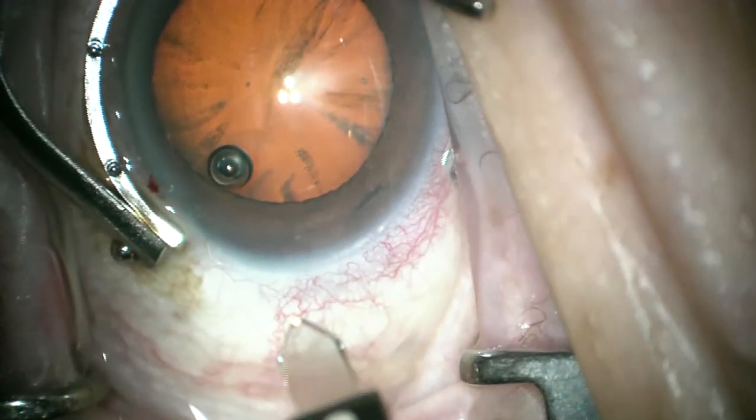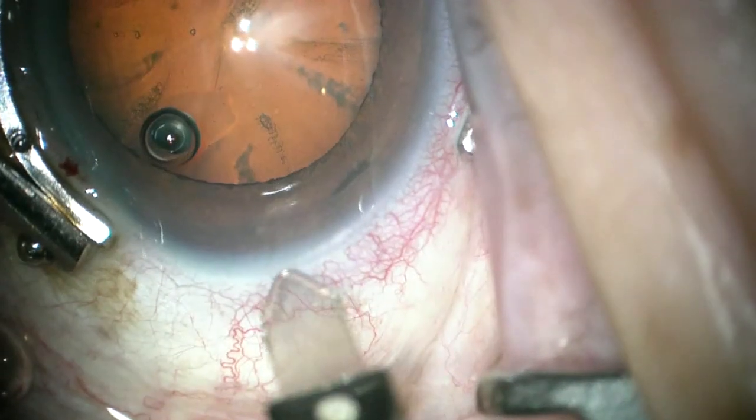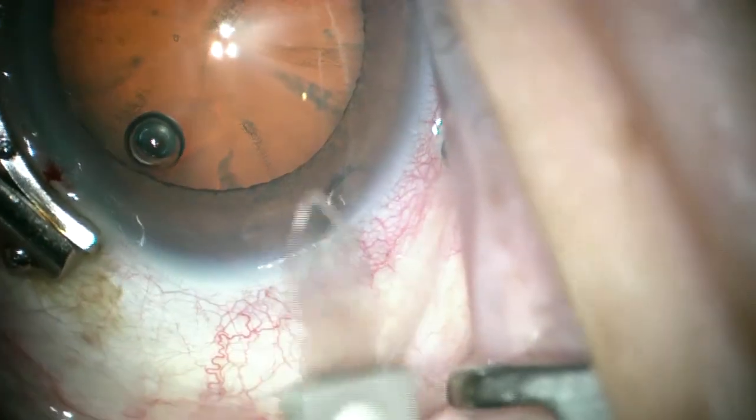This is a fine Thornton ring that I use to stabilize, making a very shallow groove right at the limbus so that I can start my incision deep at the limbus.